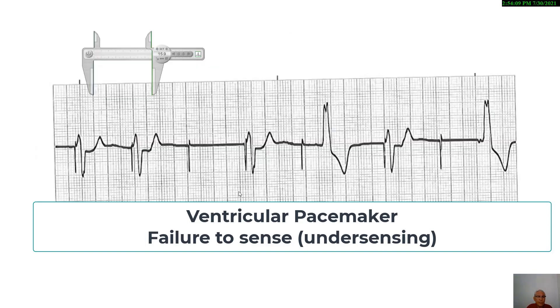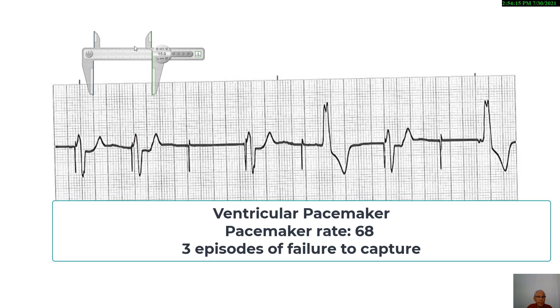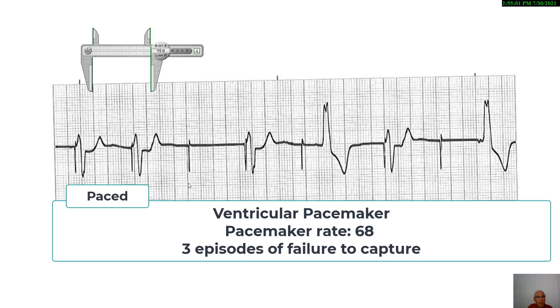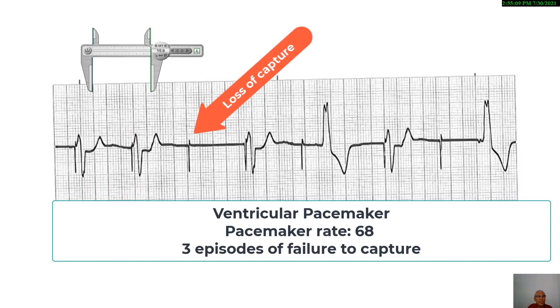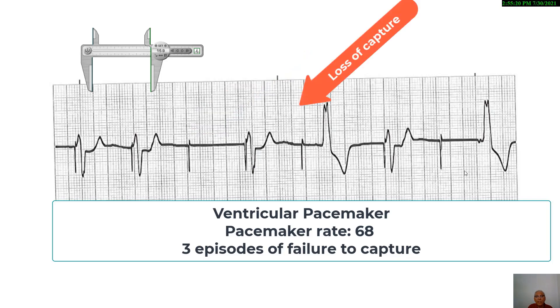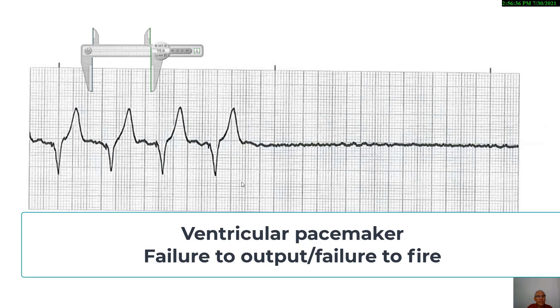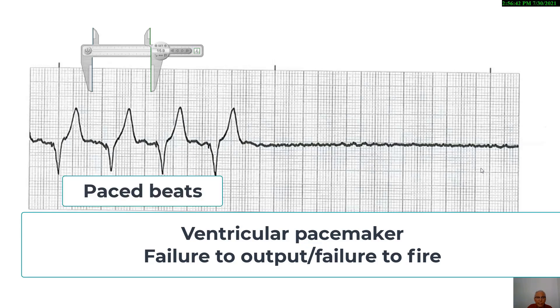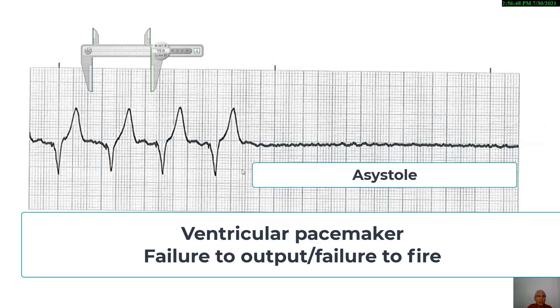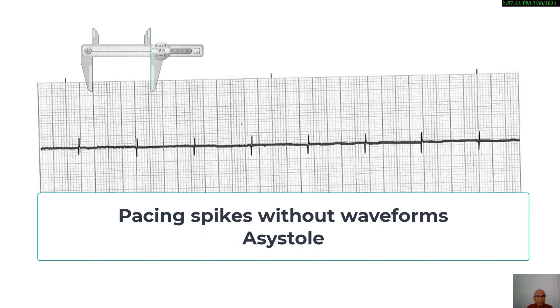In another strip with a ventricular pacemaker set at 68 beats per minute: the first two complexes appear as pace beats, but the third spike has no depolarization wave following it — this is failure to capture, occurring multiple times in the strip. In yet another strip, the first four beats are paced ventricular beats, but then there is no further activity, resulting in asystole — this is failure to output or failure to fire. A final strip shows pacing spikes without any corresponding waveforms, indicating asystole secondary to failure to capture.